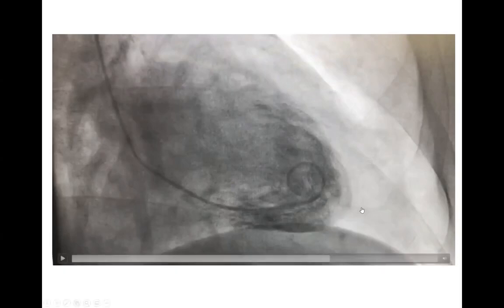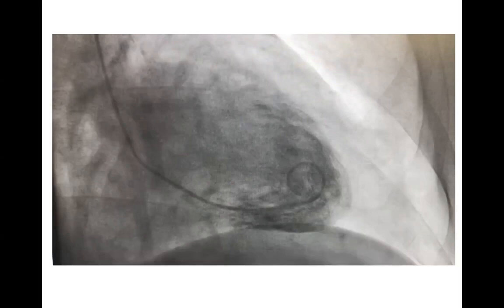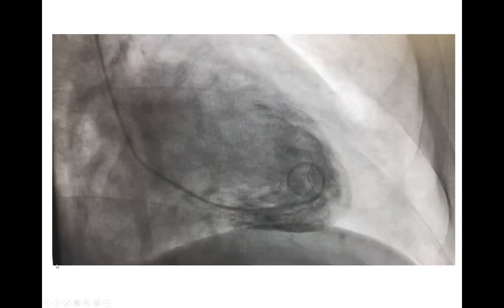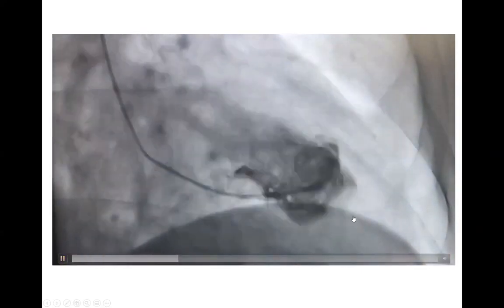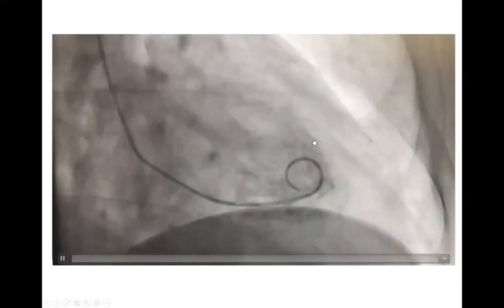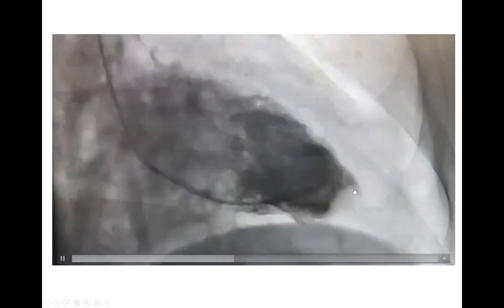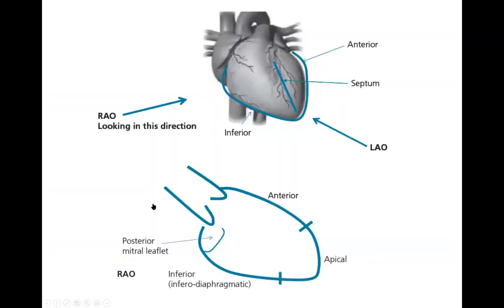It's a very significant finding — indicative of an old apical infarct. Although dyskinesis per se may also be ongoing ischemia; it does not have to be non-viable myocardium. It could be reversible. I don't think it is in this case because it's clearly chronic, and you see an apical thrombus — that's the important finding, totally missed on echo. This patient had a distally occluded LAD with absolutely no collateral. Dyskinesis is not always non-viable myocardium, but aneurysm is. This is the value of an LV gram.